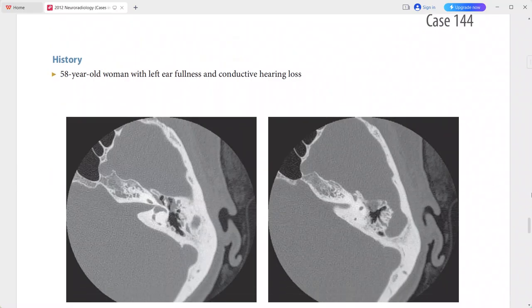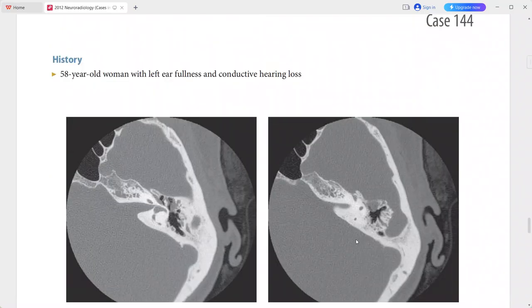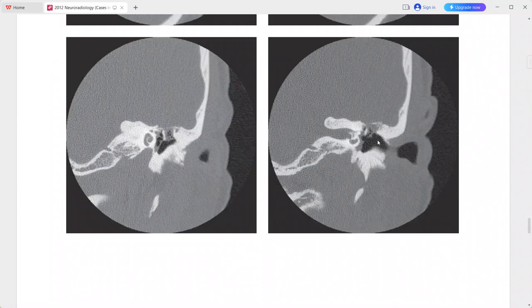Next is a 58-year-old woman presenting with left ear fullness and conductive hearing loss. The images show abnormal soft tissue in the prussak space and in the epitympanum. In these images, there is erosion or blunting of the scutum.